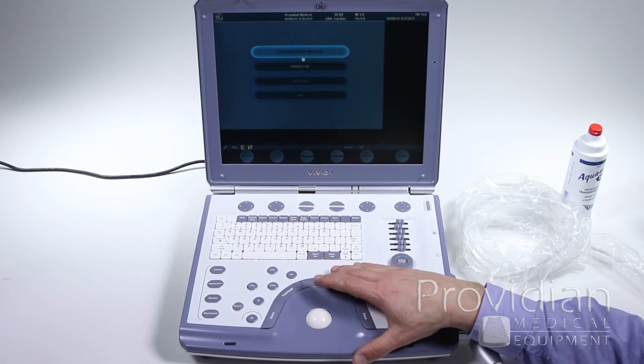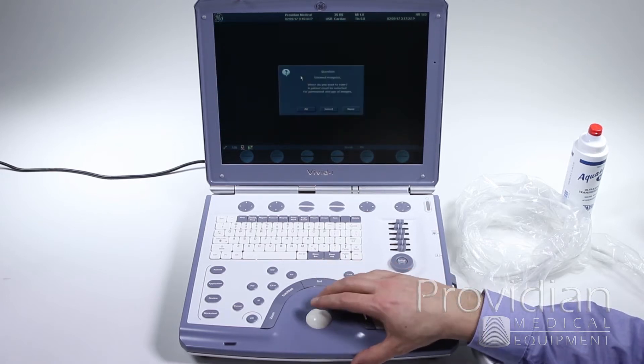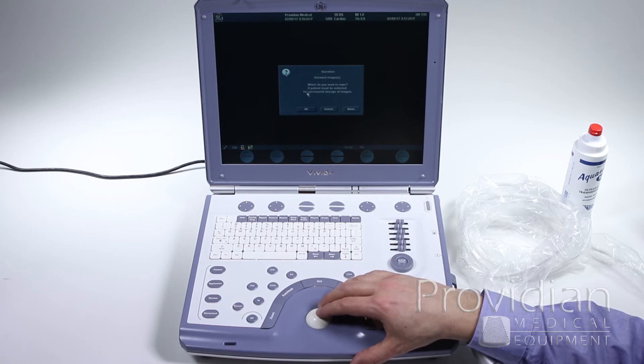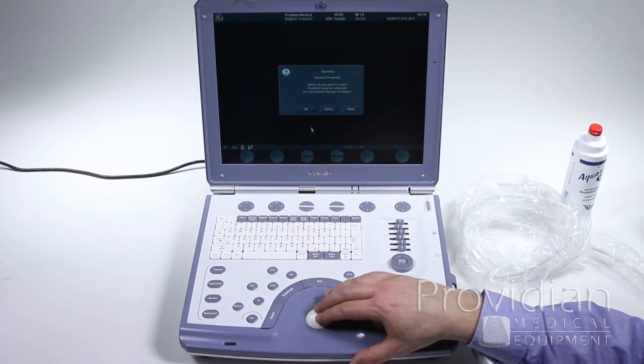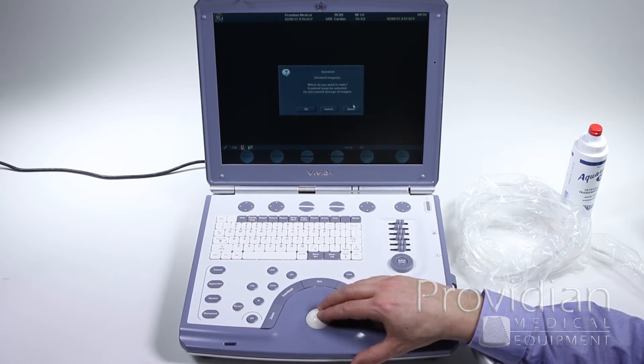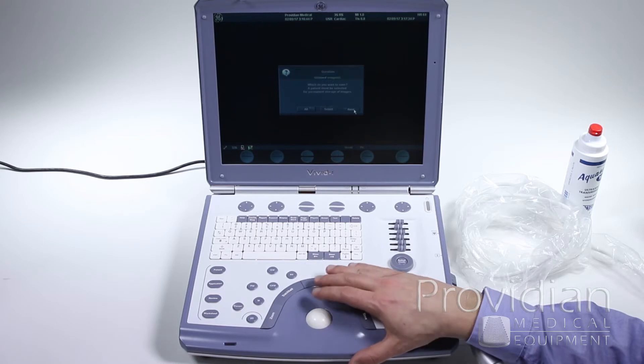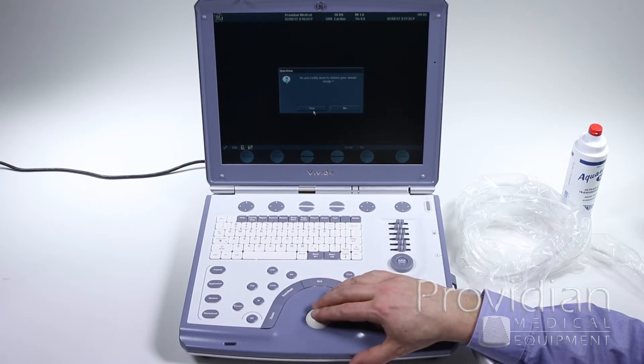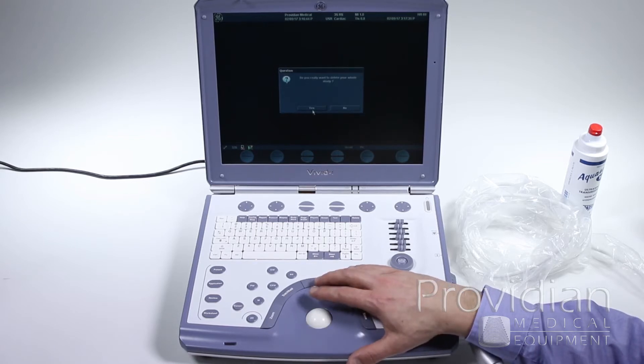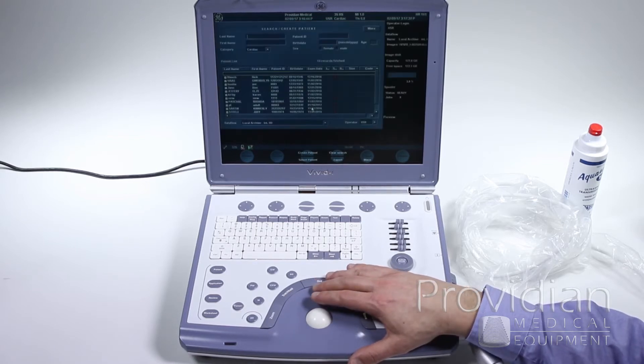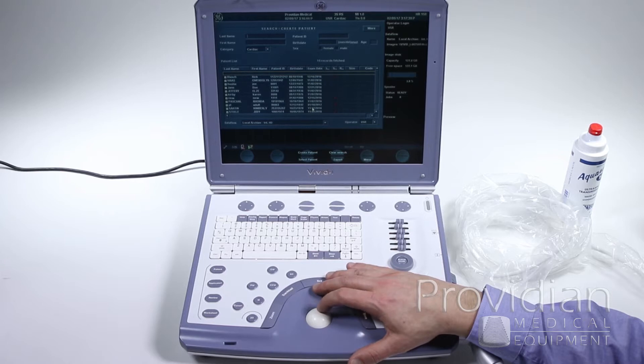Let's go ahead and create a new patient. It's saying that I had those images stored from that previous video. Do I want to store them? I don't want to store any of them. Yes, I do want to delete that whole study.